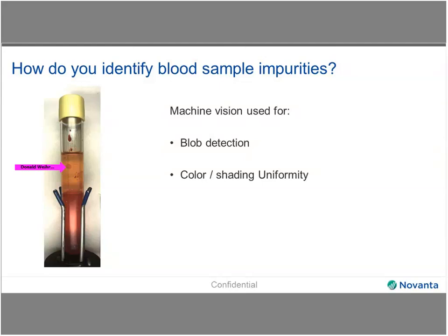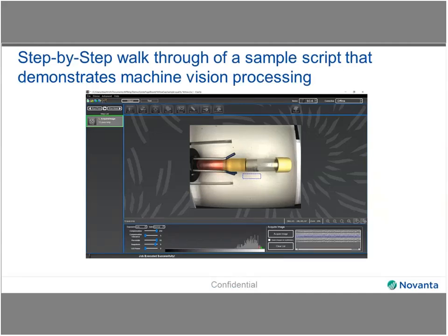The image processing is applied to highlight non-uniform color or non-uniform shading areas in the area of interest. In this case, we're mostly interested in defects within the serum area. The assessment of this clarity is based on image pre-processing and by the blob detection methodology. These are all demonstrated in more detail in the walkthrough demo. And so now we'll go to the walkthrough demo.